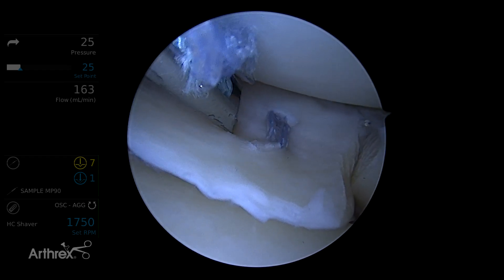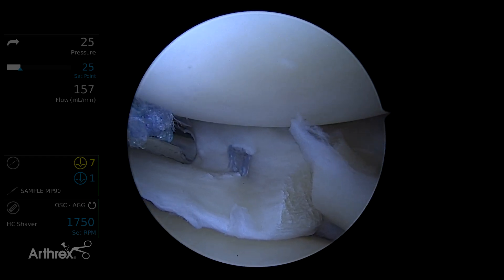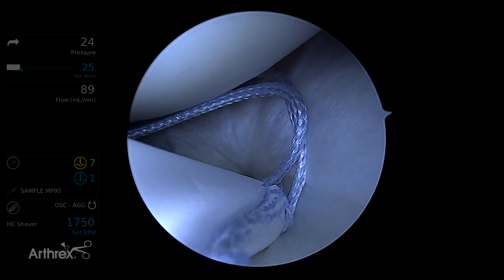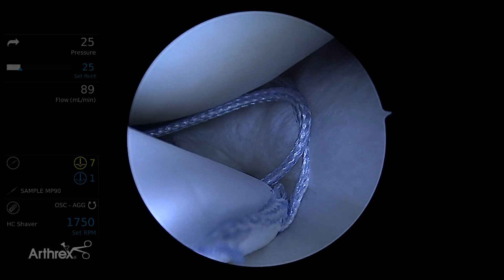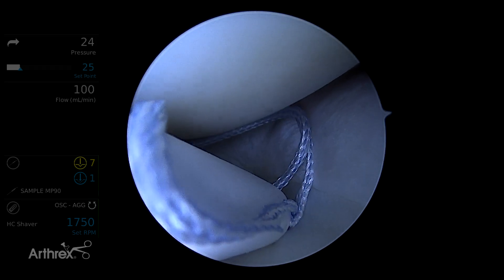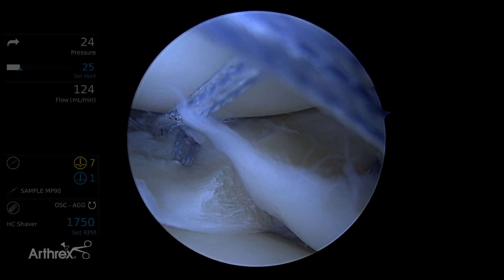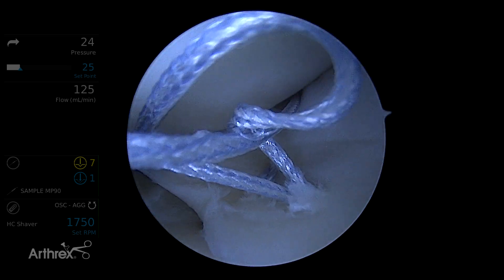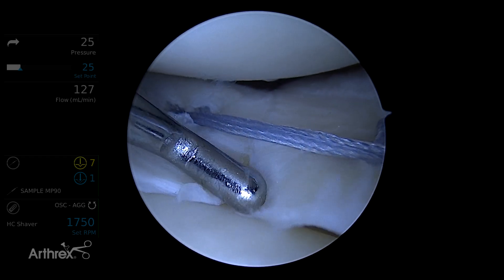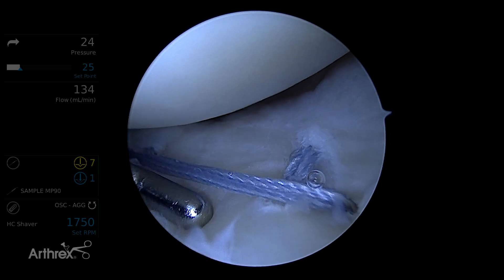We're going to go behind this vertical stitch — that creates the real ripstop effect. I can offset it that much, so there's no chance this is going to pull through. Roll all the way back, hard stop, all the way forward, hard stop. Get that view to watch that curly-Q loop crossing stitch tighten down. You can see now, in this pre-made tear, we have great coaptation, but we're not stressing through our sutures — this horizontal suture.